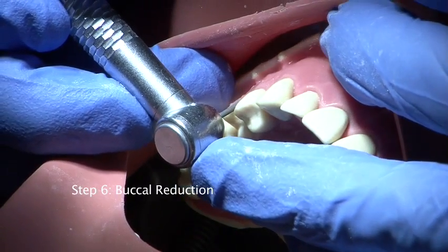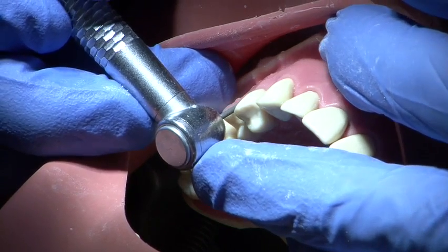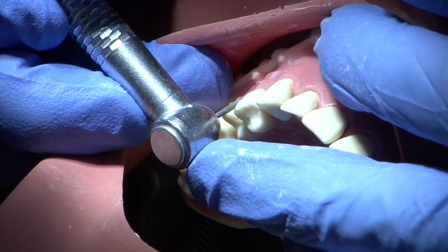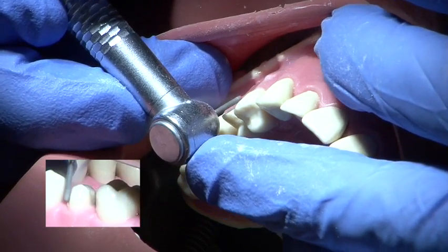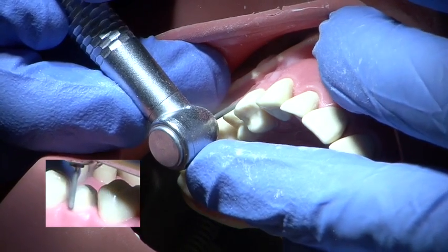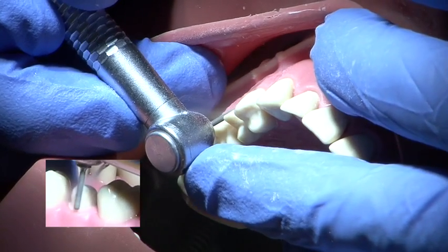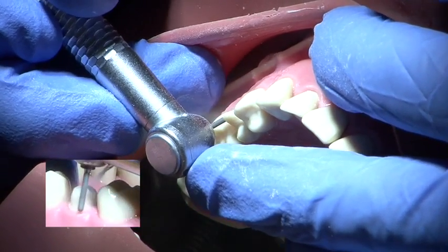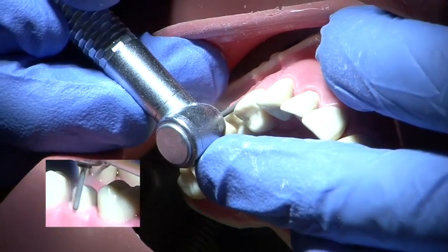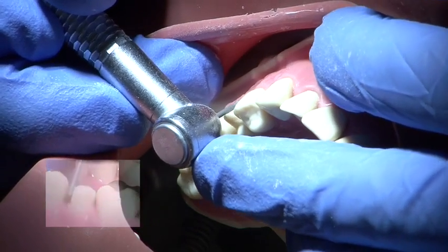Buccal surface reduction is carried out to a depth of 1.5mm to allow room for both metal and ceramic. A deep chamfer or shoulder preparation is achieved using a parallel sided round ended medium grit burr. It is important that the outline of the gingival contour is followed so that the margin is not readily apparent. A smooth continuous action will ensure a smooth margin.